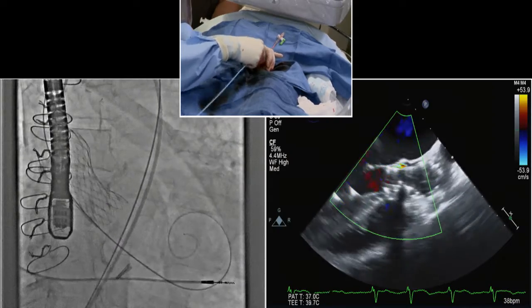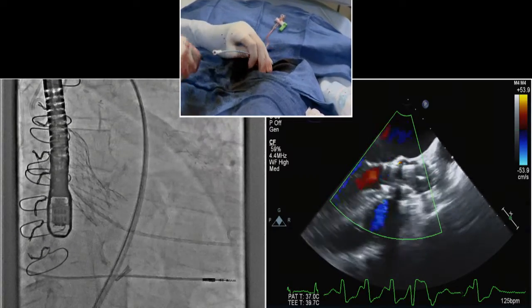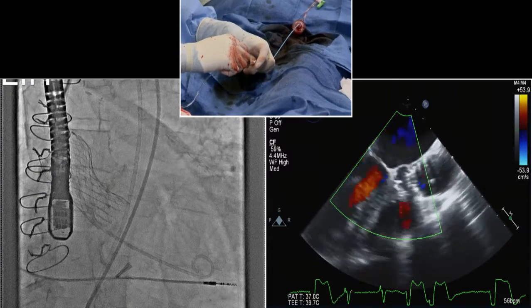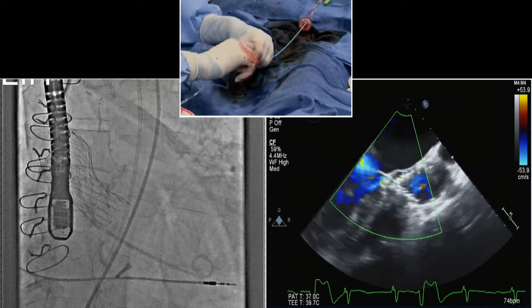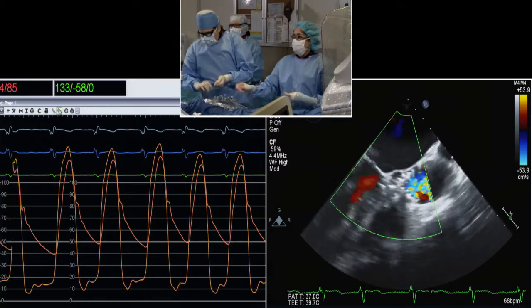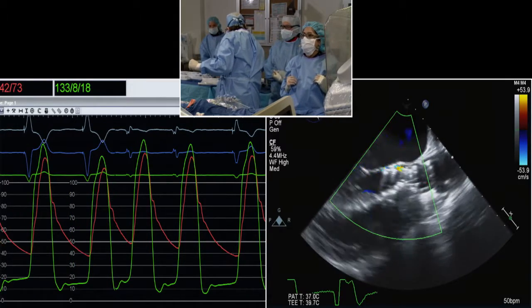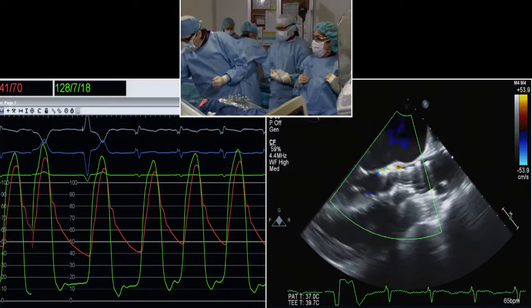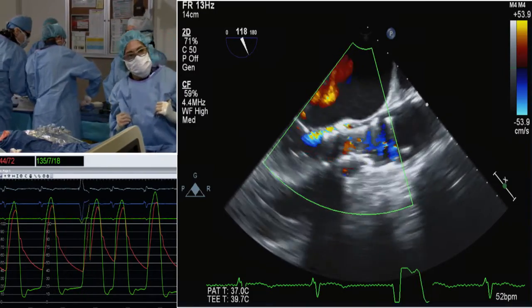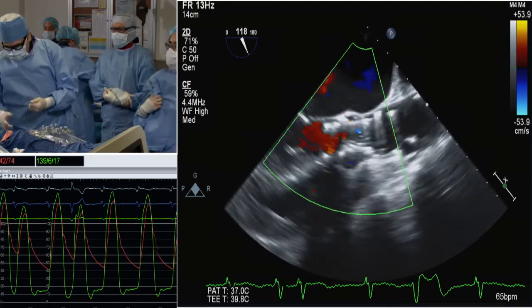Okay. So, I wouldn't say that I'm opposed to predilation. Within our group, we have a bit of a spectrum. And I would say when I started a few years ago, we were predilating everybody. And when we went to not predilating, somewhat uneducatedly, we didn't predilate anybody. And now we're coming to a better understanding of the patients in whom we should. And I would say in general, we are predilating patients with, almost counterintuitively, a very tight valve and bad LV dysfunction. We are predilating, but not very aggressively, accepting that they are going to get some burst pacing, which I've been surprised that they've been able to tolerate, mostly because during the deployment, when you don't predilate in somebody with bad LV dysfunction, they become unstable.